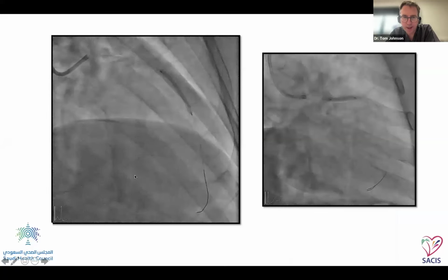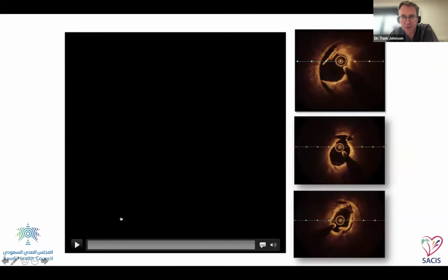Merva, can you go back to the last image just because it's interesting. Obviously, you show very extensive injury. But actually the calcium, you might argue, in that first top panel is a very large boulder of calcium. You can't see the deep wall. You can only see the luminal surface where you have that clear demarcation of intimal tissue into calcium. And so mechanistically, you can understand that having blown up a balloon, you've just created injury at the shoulder regions of that plaque, which is why you see those two dissection planes.